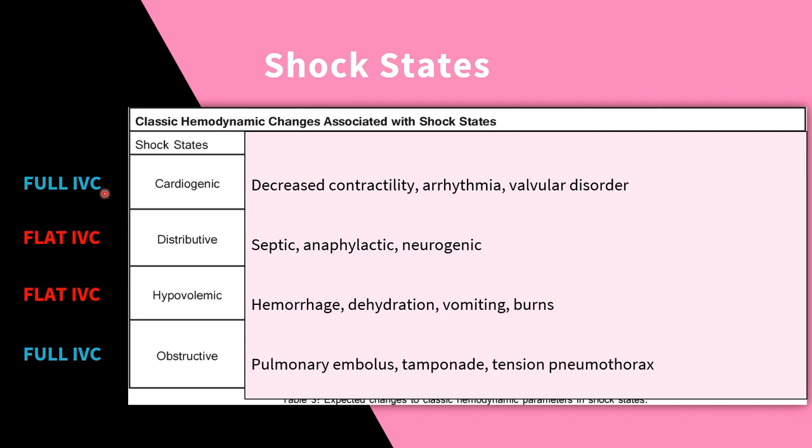Notice that if you have a full or plethoric IVC, this is most likely cardiogenic or obstructive shock. Whereas if you have a flat IVC, this is most likely distributive or hypovolemic shock.